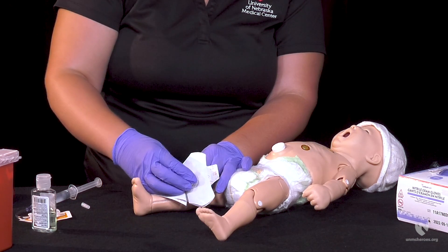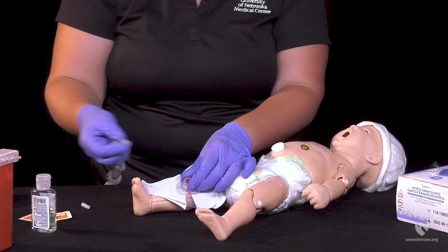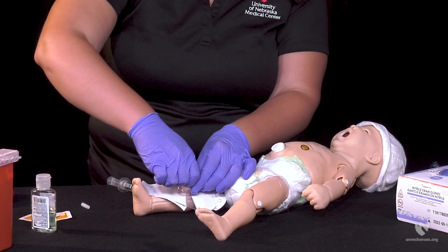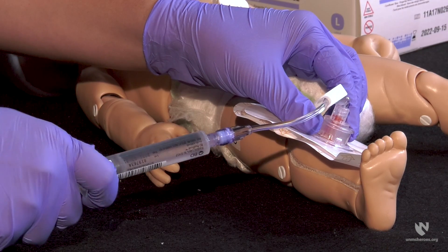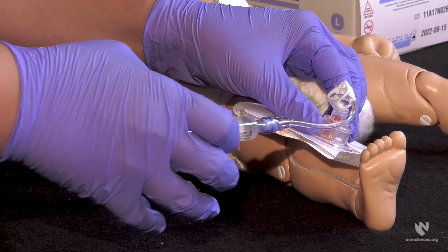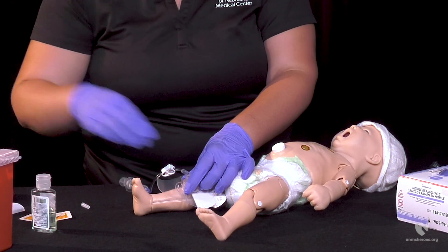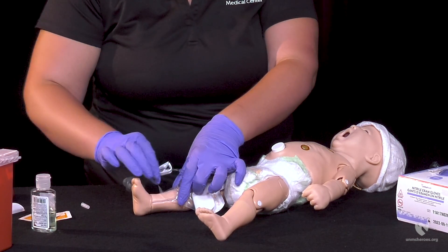Next, place the securement dressing, then attach the primed extension set, maintaining sterility. At this point, the inserter can aspirate to see a flash of blood if your facility protocol allows. Flush your IO line and ensure there is no leaking around the site. This may be extremely painful — consider appropriate analgesics.